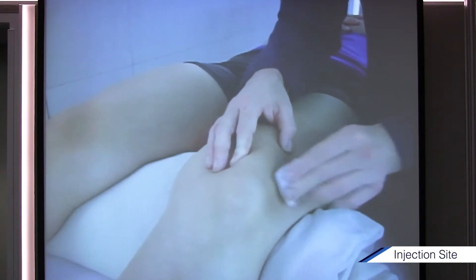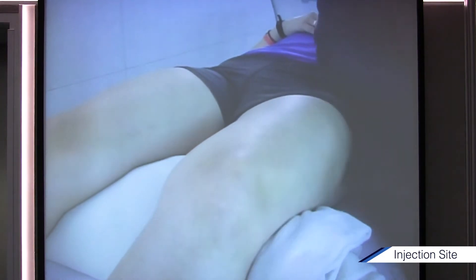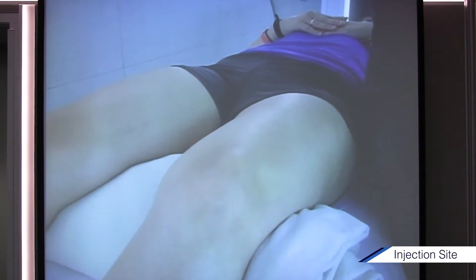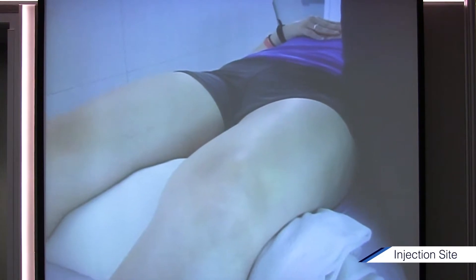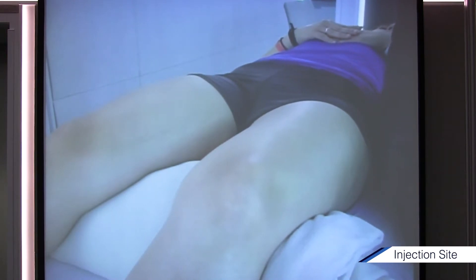For the knee injection I don't use betadine — it hasn't been shown to be any better. I tell the patient what I'm doing: I'm going to clean your skin with alcohol and let it dry. We do that for two reasons. First, if you wipe it and then shove a needle through it while still wet, it hurts just as much as getting alcohol in a cut. That's why kids hate shots — wet alcohol going into the wound. Letting it dry also kills more bacteria.